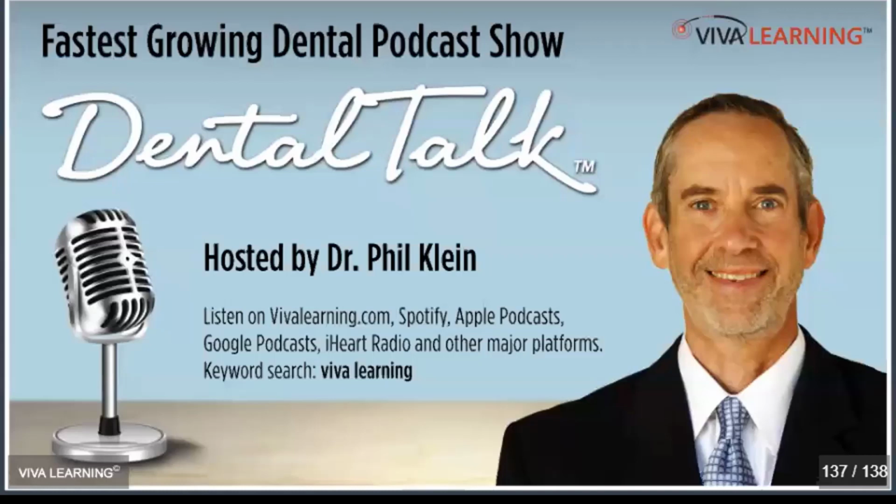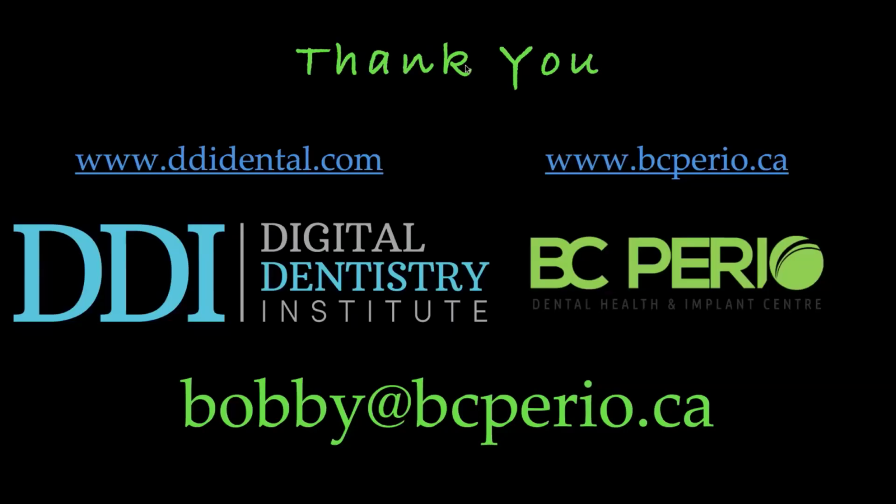Another question is, how do you pick a cone beam CT scan machine? Well, when I decide on a cone beam CT scan machine to pick, the advice I always give is base it not on price, but base it mostly on the software that's utilized in it. Can you use software that's going to allow you to do what we do, in the sense that you communicate to our patients, make it seamless, make it easy, make it quick, and also be able to really provide that information to your patients and your colleagues.